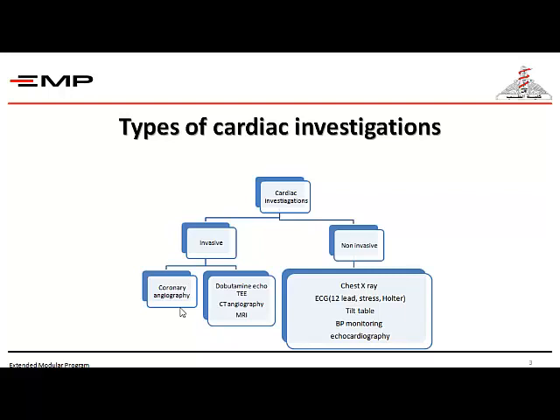The CT angiography, where a dye, the urografin or ultravist, is introduced through a peripheral IV cannula inside the patient's body, and the CT views are taken. And the magnetic resonance imaging, or the MRI, where you introduce a gadolinium substance, with some electromagnetic properties, to have the images of the cavity and the blood flow and so on.